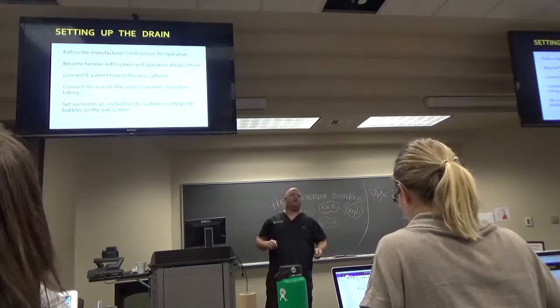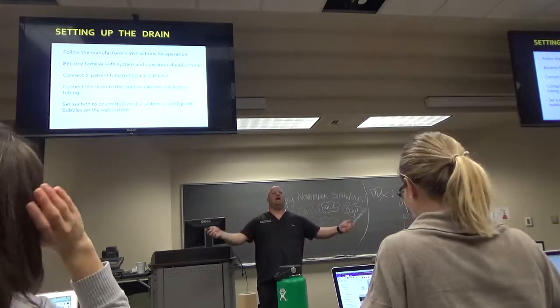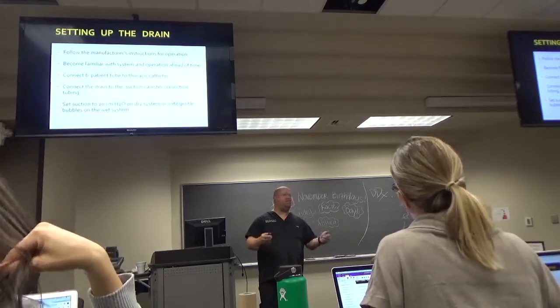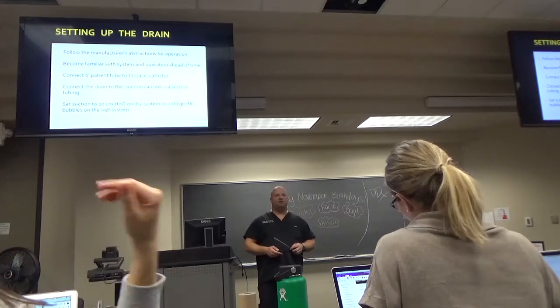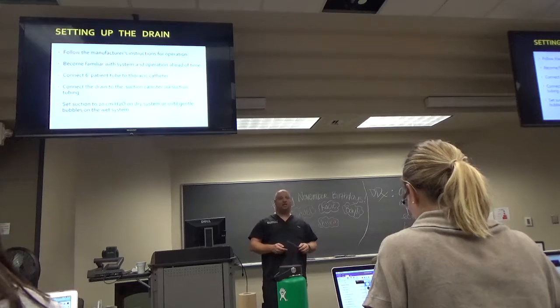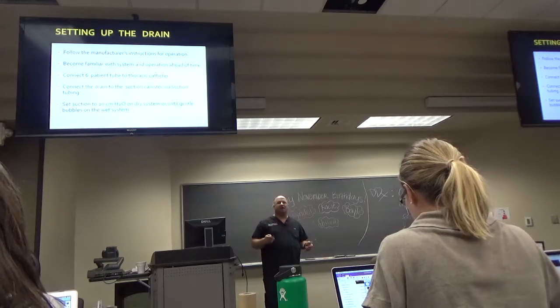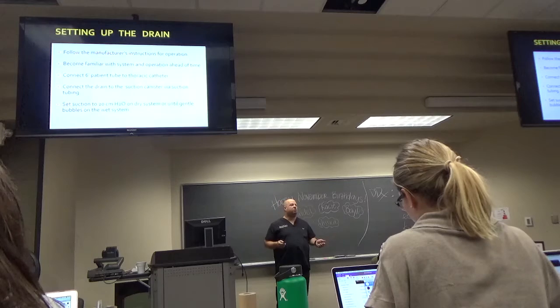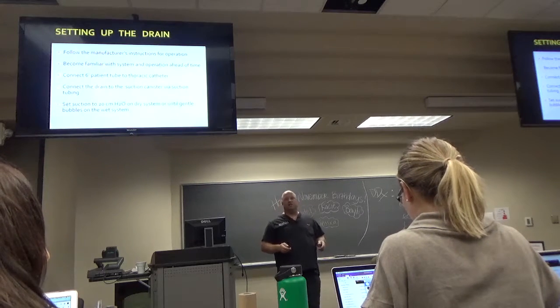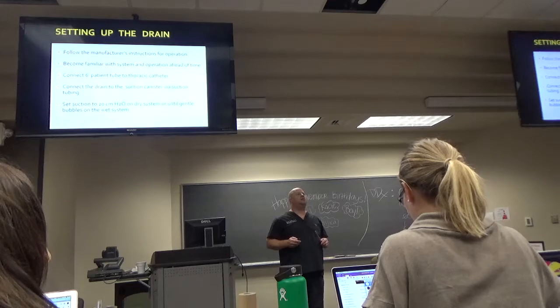You know, when you work in a hospital, no matter what equipment you have, whether it's your pleurovac, your airway equipment, your intubating equipment, your EZ-IO drill, your cric kits, be familiar with what you have, okay? And get out and play with it. Because the last thing you want to do is open up some box or some equipment you've never used when you get a traumatic patient in and you've never used it before, okay? You want to know what you have.